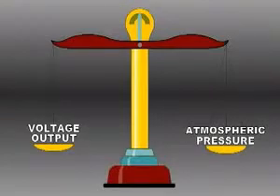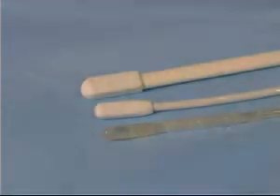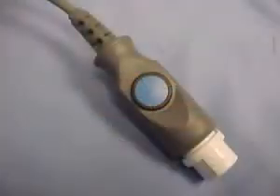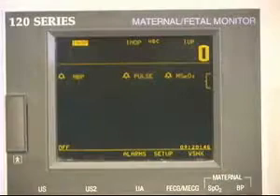A true zero reading is established only when the transducer is exposed to atmospheric pressure. Transducer-tipped catheters cannot establish a true zero in utero because the transducer is in the uterus and subject to intrauterine pressure. To compensate for this limitation, a switch is often installed on the cable or catheter to short the input wires so that a zero differential voltage is placed on the monitor input. This process of electronic zeroing does not ensure a true zero reading.